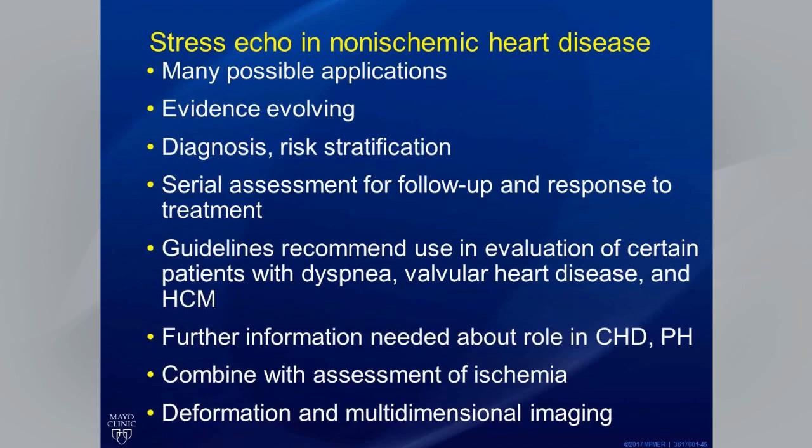In all of these patients, we can combine our Doppler assessments and other parameters with our wall motion assessment for ischemia. In the future, we will likely be using deformation imaging and multidimensional imaging in our assessment and use of stress echo in non-ischemic heart disease.